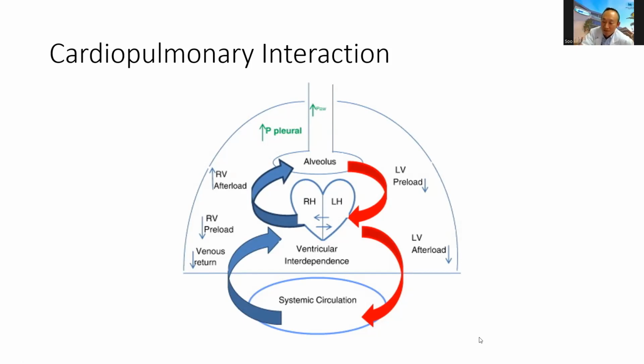Thank you for sharing. I'm always confused when you say you increase the inspiratory time and also increase the minute ventilation for this group of patients by increasing the rate sometimes. How will you set the IE ratio for this group of patients? I always get confused in regards to this, because you are going to compromise the expiratory time also. Can you advise us on that? And then the other thing, when a patient, this is the first question.